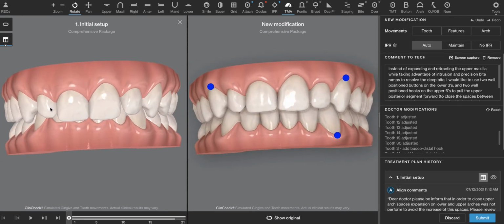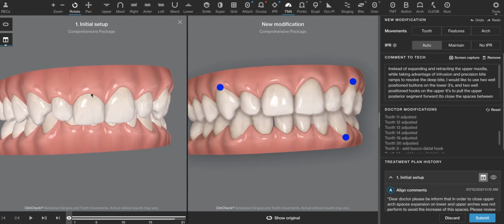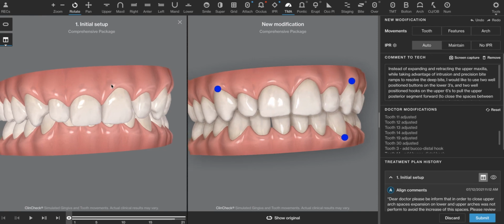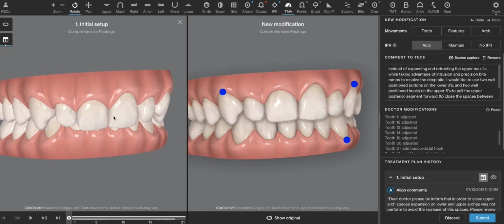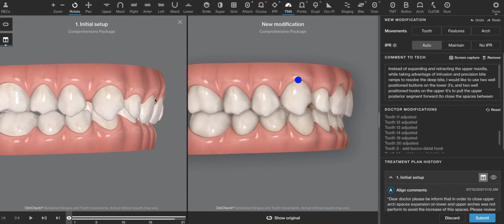This is definitely a case for VPRO or even Propel. Propel is using the RAP phenomenon where you induce inflammation in the area to help the teeth move more readily. But I would start with just the VPRO 3 times a day, 5 minutes, having the patient bite into the trays or bite into the VPRO as much as possible, helping to induce the seating of the trays, because the power ridges that are going to sit on the teeth that help to tilt the tooth backwards are going to have to be engaged in the proper spot.